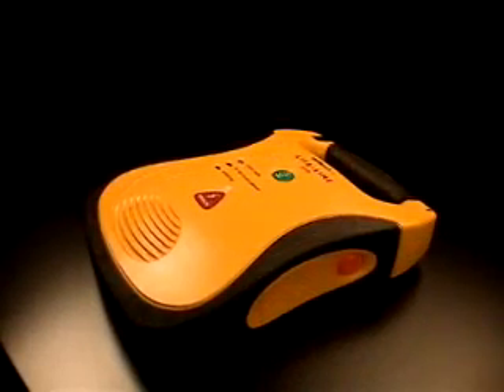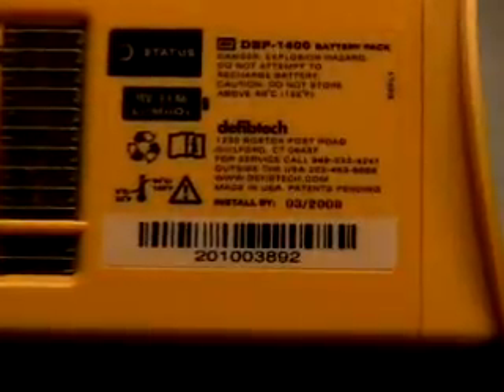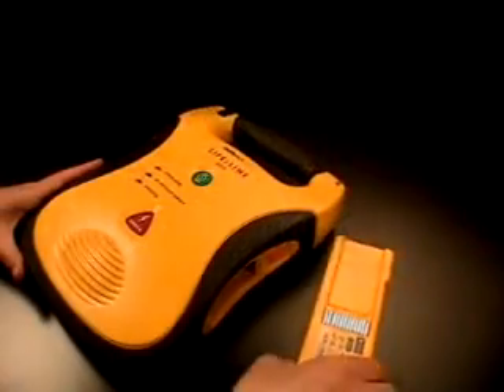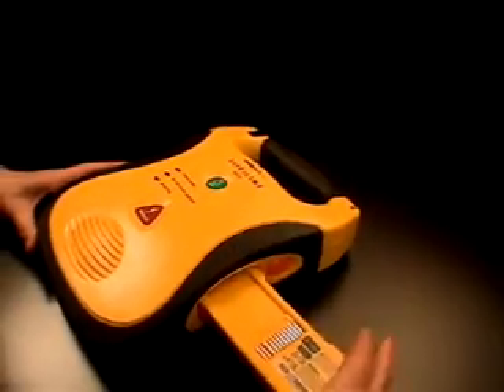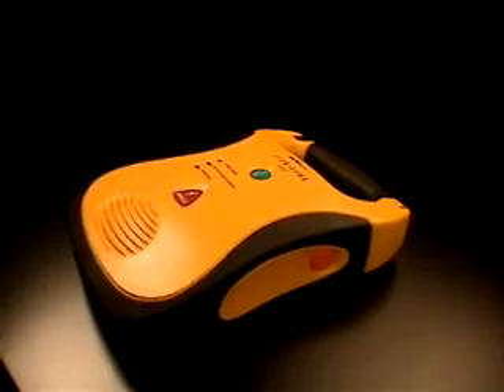Always store the AED with the battery pack installed. If you have a spare battery pack, check its install-by date, which is printed on the label — the battery pack should be installed into an AED before that date. After the battery pack is installed in a unit, the AED will monitor the condition of the battery and inform you when the pack should be replaced.